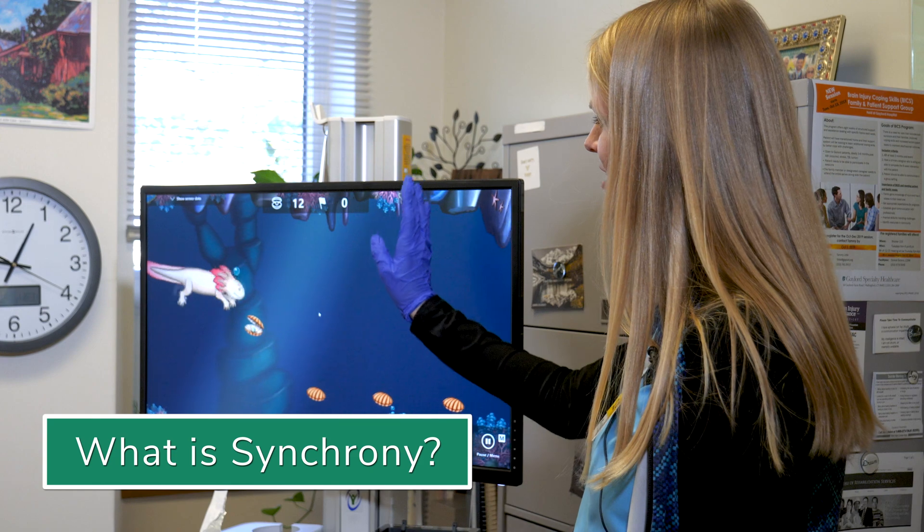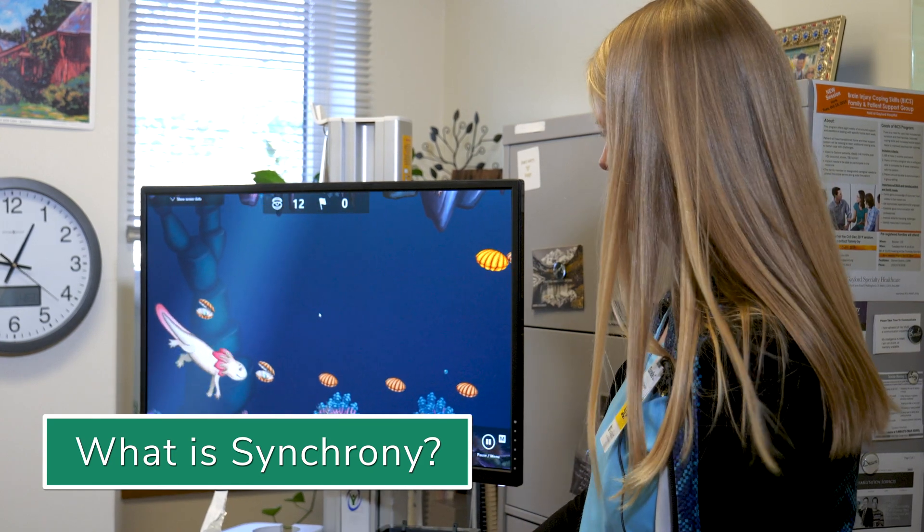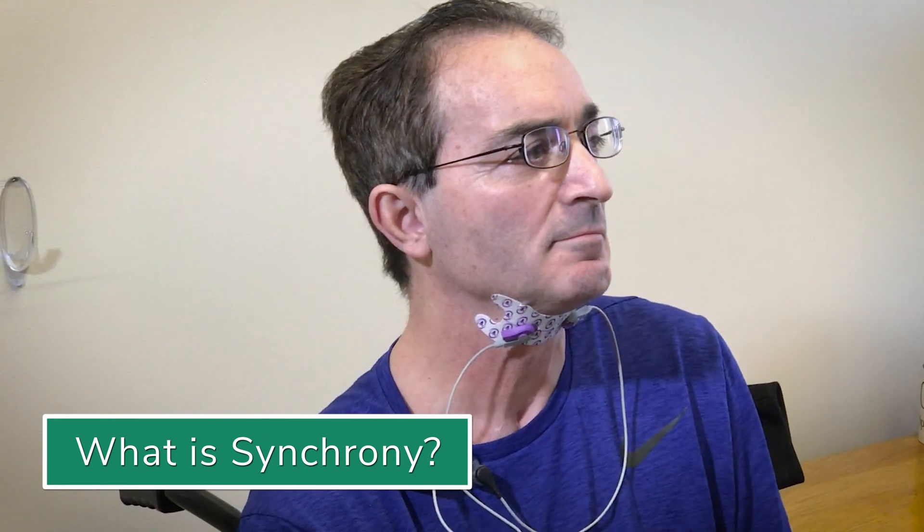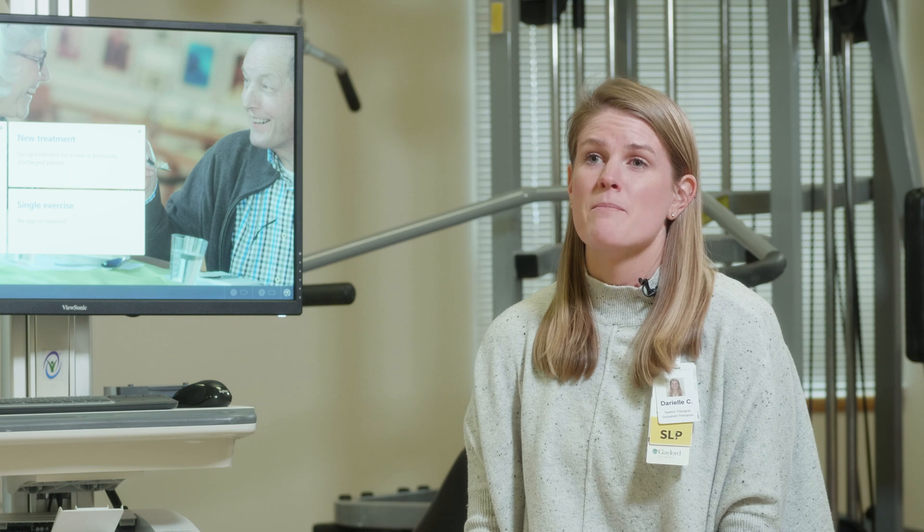Synchrony Therapy is a virtual reality surface electromyography biofeedback system — essentially it's biofeedback for the muscles that are involved in the swallow.